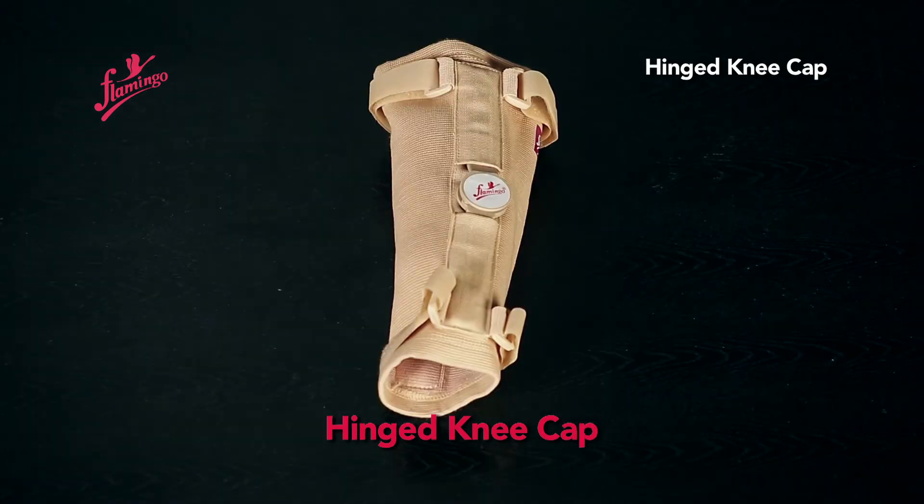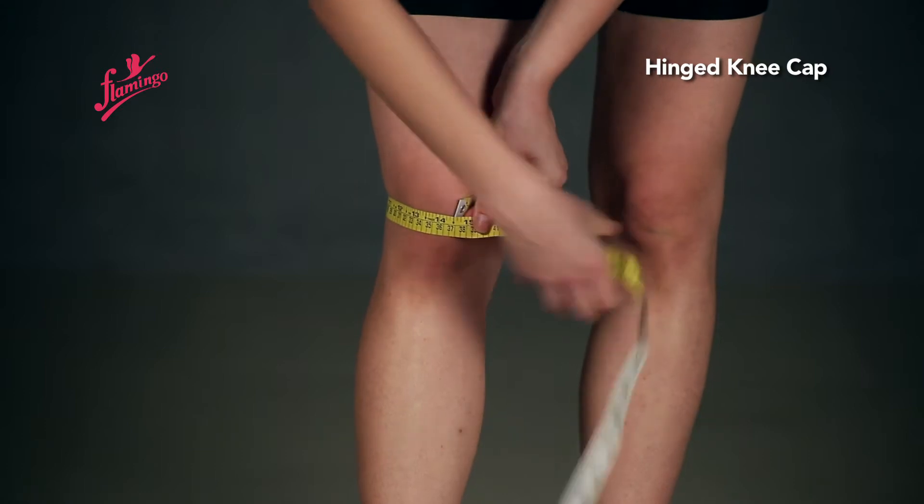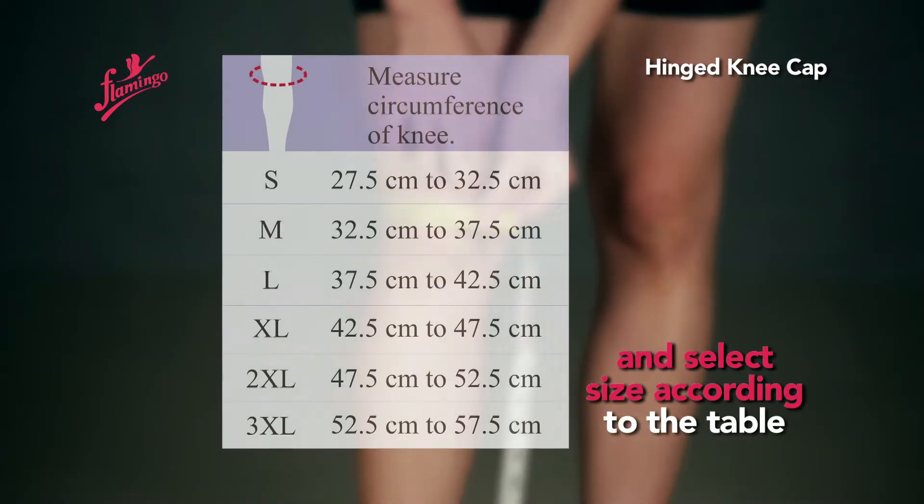Hinged Knee Cap. Measure the circumference of the knee and select the appropriate size according to the sizing table.